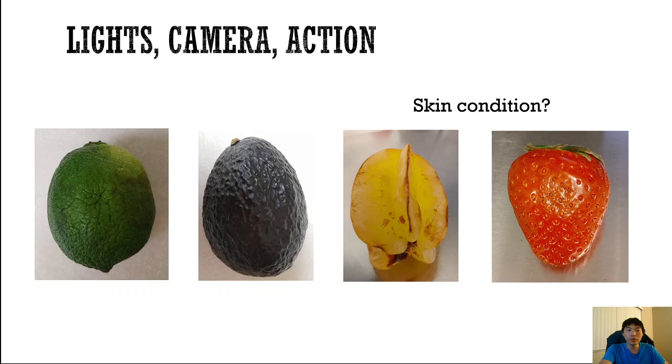Now, in terms of looking at the fruits, we're seeing mostly the surface, and that's because with optical imaging, the depth of penetration is very low, and so you don't really see very far deep into the fruits, but that doesn't mean that we can't see inside the body. We actually have cavities in the body where we can insert a camera. And this device is a medical device known as an endoscope.